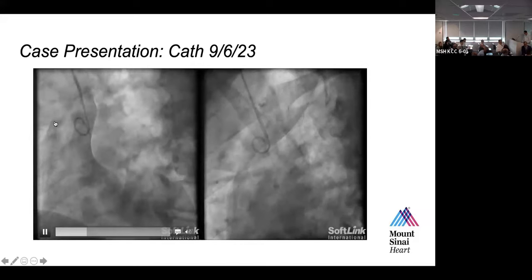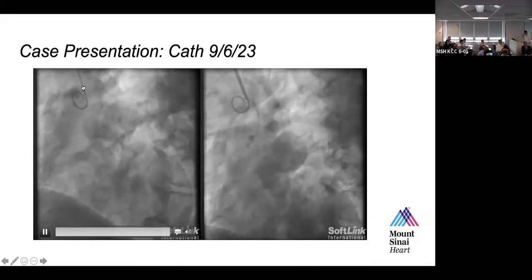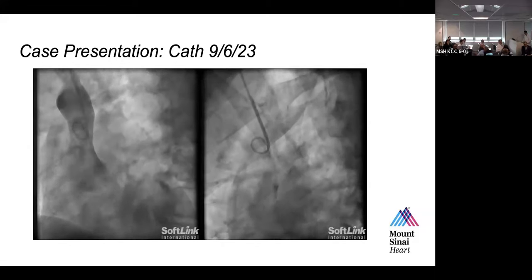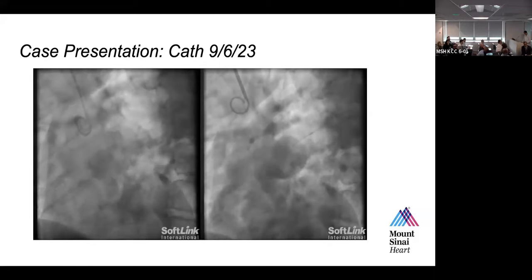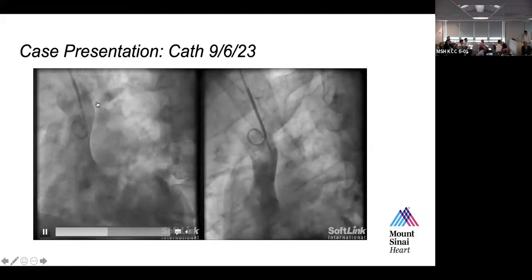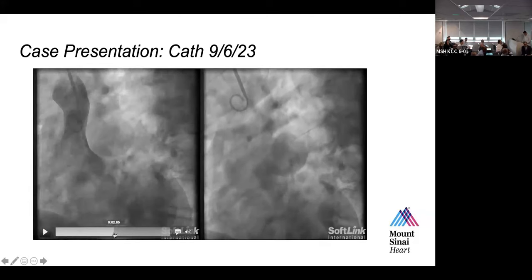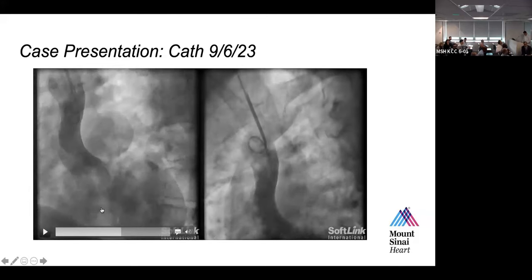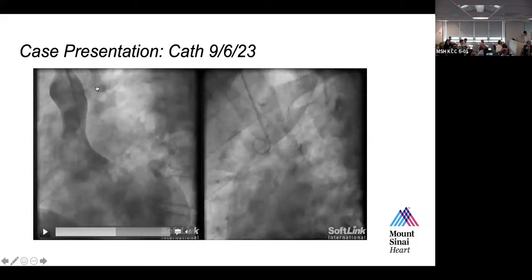This is a special image requested. You can see the azygos on top of the right of the screen at the top where the arrow is, where the little hand is. Can you put that with the azygos? Right there. Can you freeze it? Yeah, it's up there, goes to the right there. You see the first shadow is up there, right there.